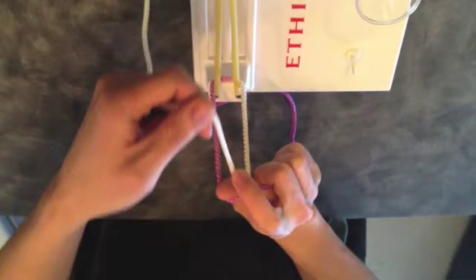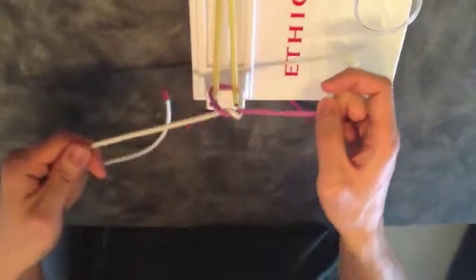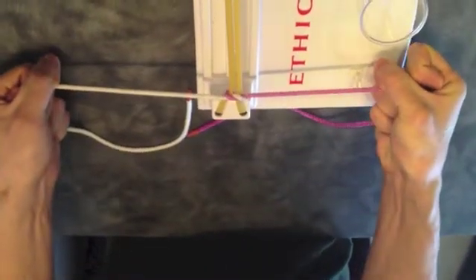Cross the strand in your left hand into the center of the 4 and push the strand through the loop with your right index finger. Re-grasp the strand with your left hand and pull your hands apart to secure the first throw.